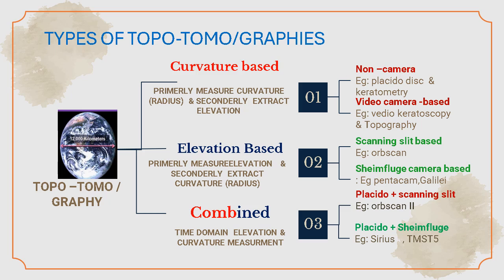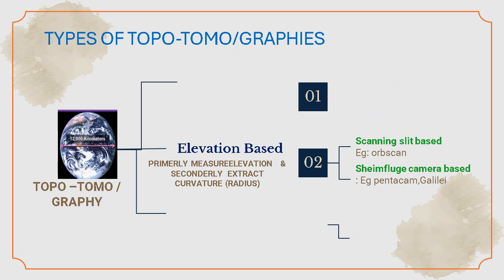Now the time has come for the last type of corneal topography, the elevation-based, which is the Scheimpflug-based corneal tomography. This type of tomography is now the trend in the field of corneal imaging. The most common are the Pentacam and the Galilei line. We will speak a few words about these systems.